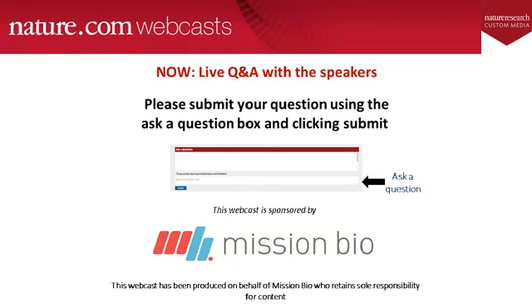Yes. So we worked very hard to get our cell capture rate to 10%, and as we further develop the platform, that number will be improving. So for 100,000 cell input, we get a 10,000 cell output of cells that have usable genotype. In terms of the doublet rate, we have an extremely low rate there, and it's driven specifically by Poisson statistics. So its performance in terms of doublets is on par with any other commercially available droplet-based platform.